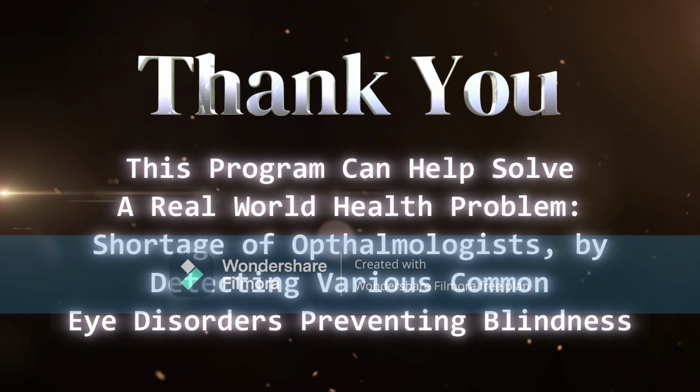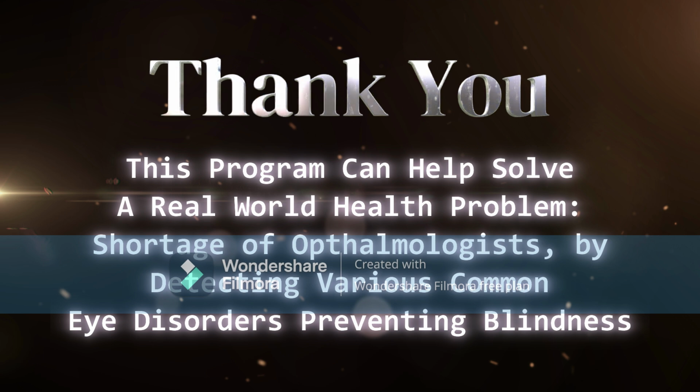This program can help solve a real-world health problem, the shortage of ophthalmologists, by detecting various common eye disorders and preventing blindness.